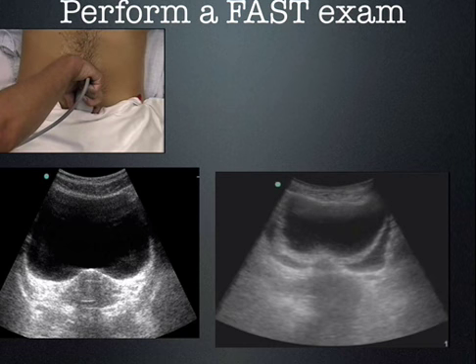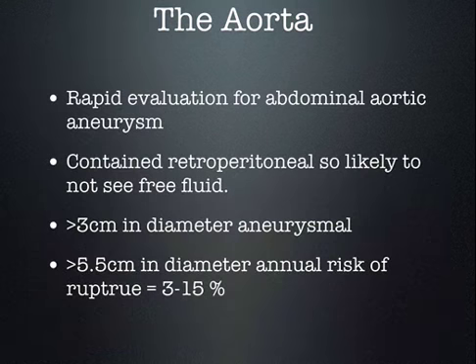Here's the pelvis. Here's the bladder. We're looking lateral to the bladder, and you can see here clearly contained fluid. We know it's in the area of the bladder, so this must be the urinary bladder because we're looking in the pelvis. Whereas this is free fluid, and it tends to take these sharp points because it's settling in all the nooks and crannies. That's one of the ways you can differentiate contained fluid from free fluid.